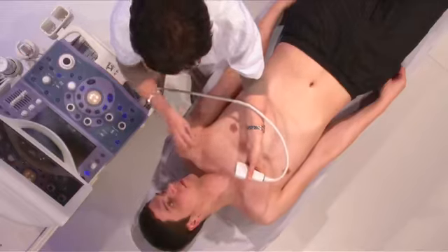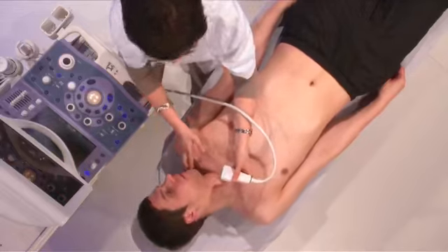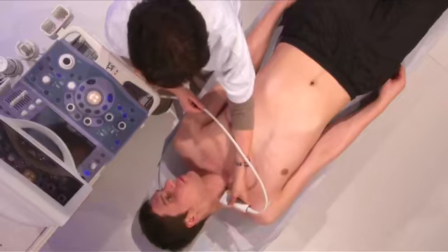But don't change, otherwise you might be mistaken. So I'm going to begin with the right side of the patient, and I ask him to turn his head like that. This patient was admitted for a stroke in the territory of the left internal carotid artery.